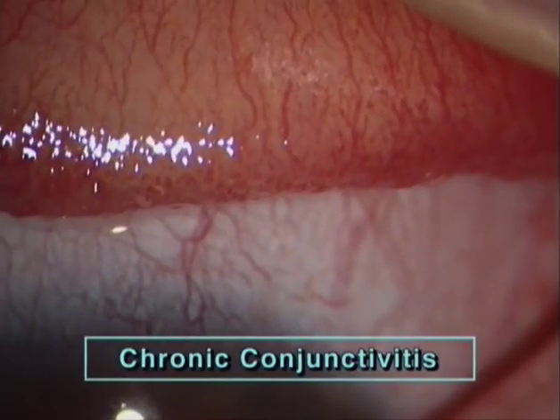In this case of chronic conjunctivitis, the carpet of the papillae is easy to recognize because it shows not only irregular reflexes, but also hundreds of conspicuous capillary buds separated by clear tissue. The ramifications of the capillary buds have expanded into a net of larger loops, and this is why they appear so distinctly.